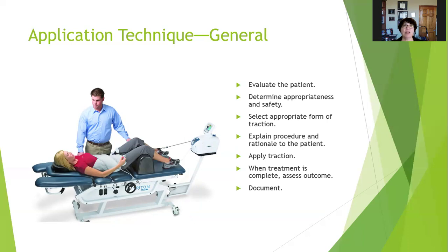If someone has severe pain and you put them on mechanical traction and their pain immediately goes away, gradually decrease the pressure and take them off the traction because something else is going on.